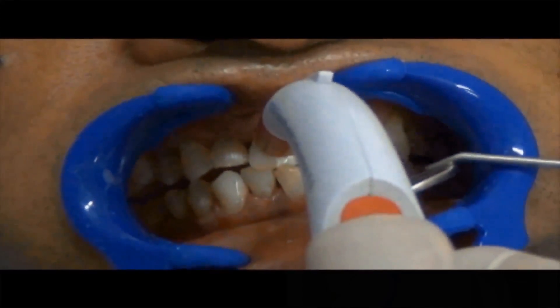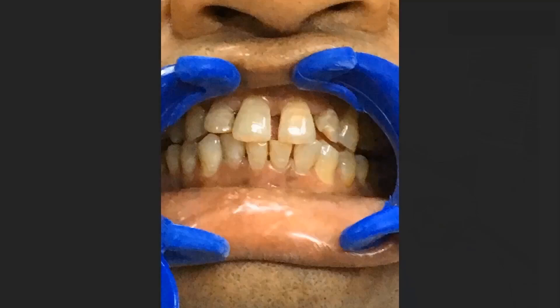Check the shade using the spectrophotometer. Remove the cheek retractor and check if the patient is comfortable.